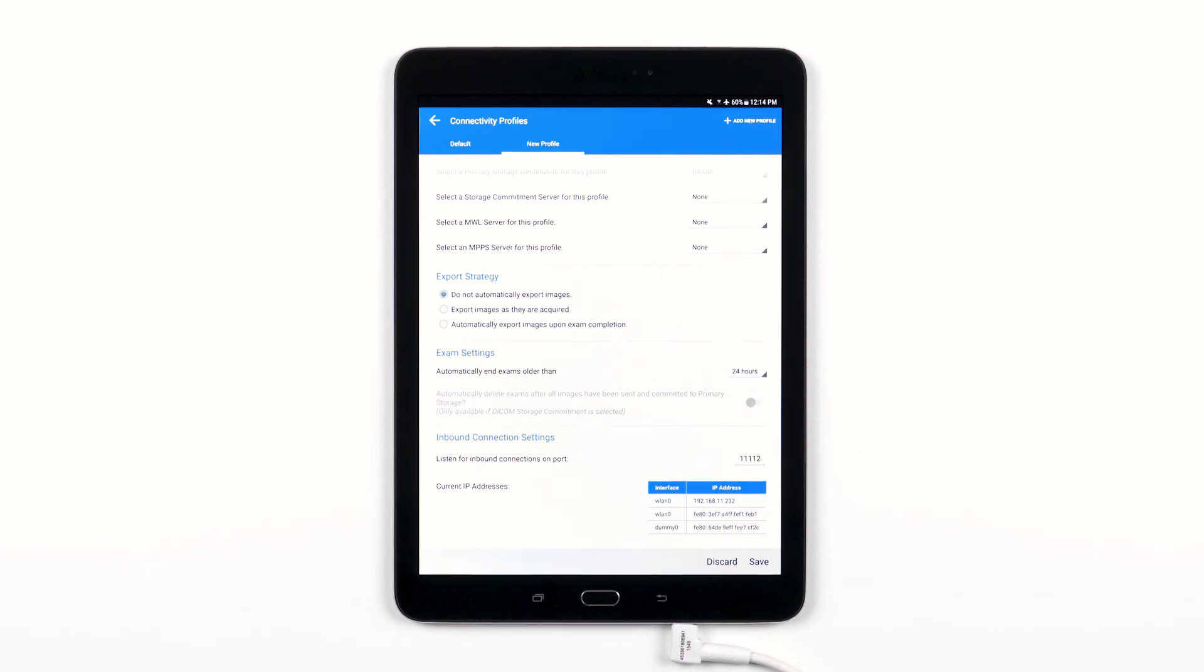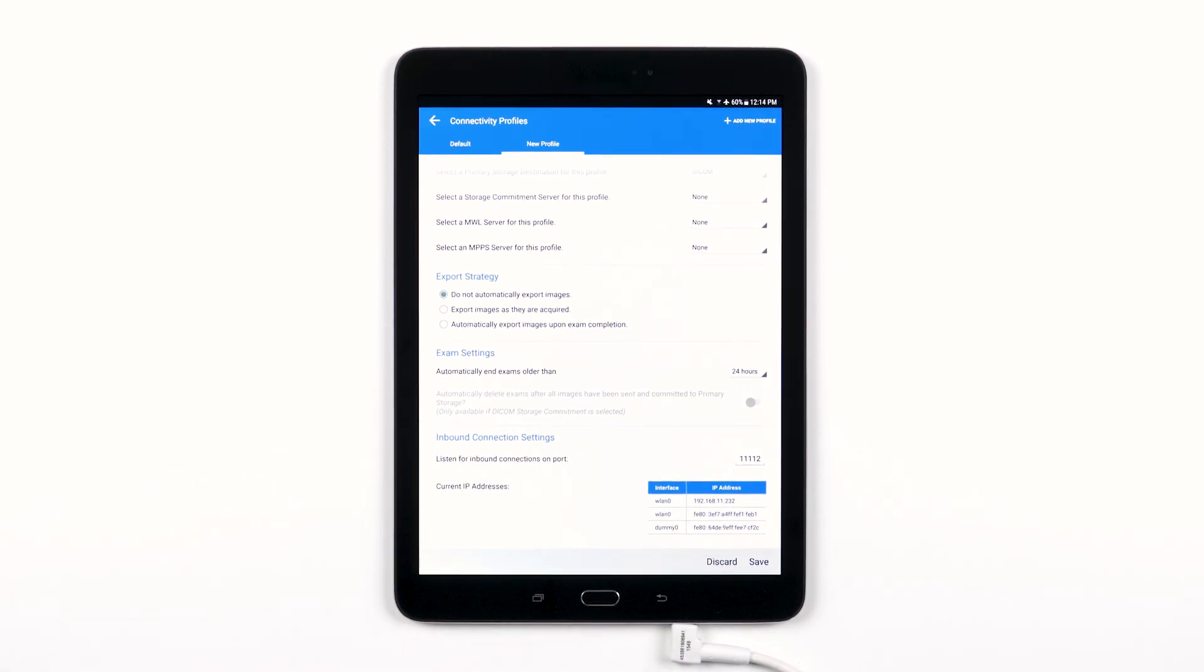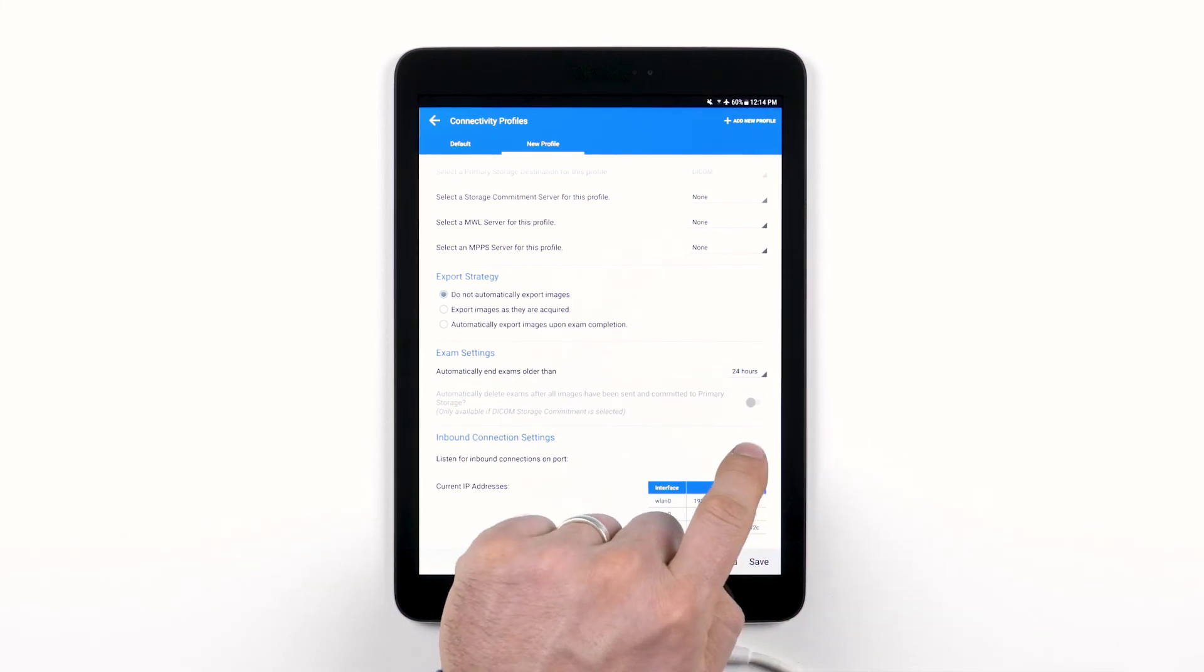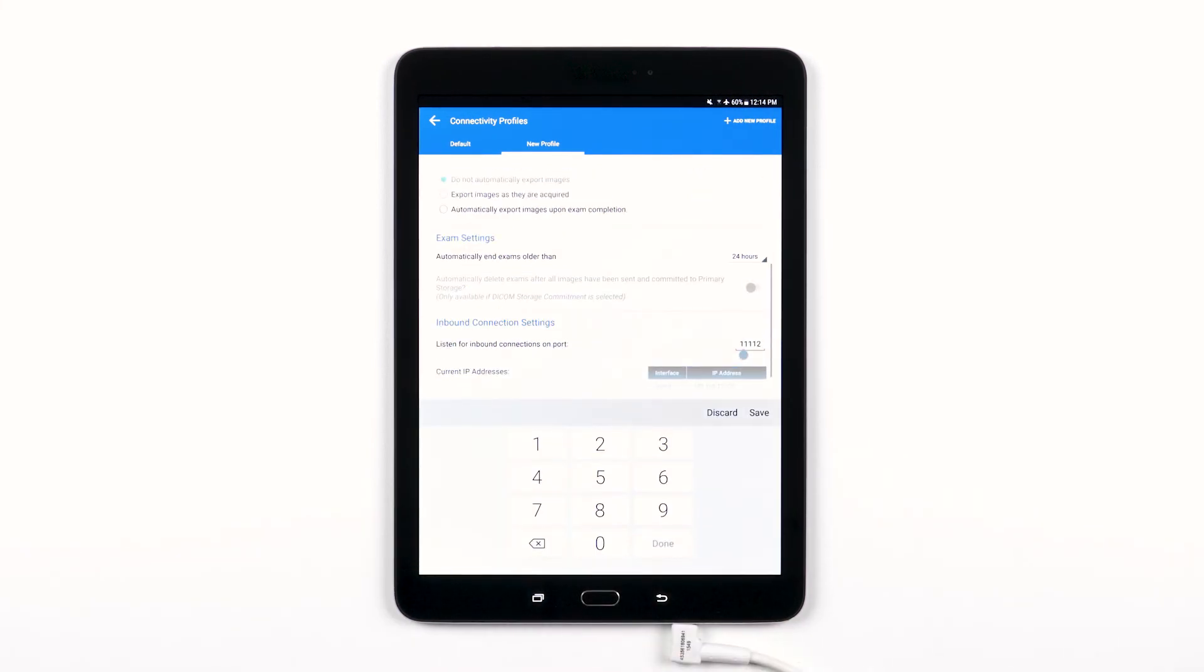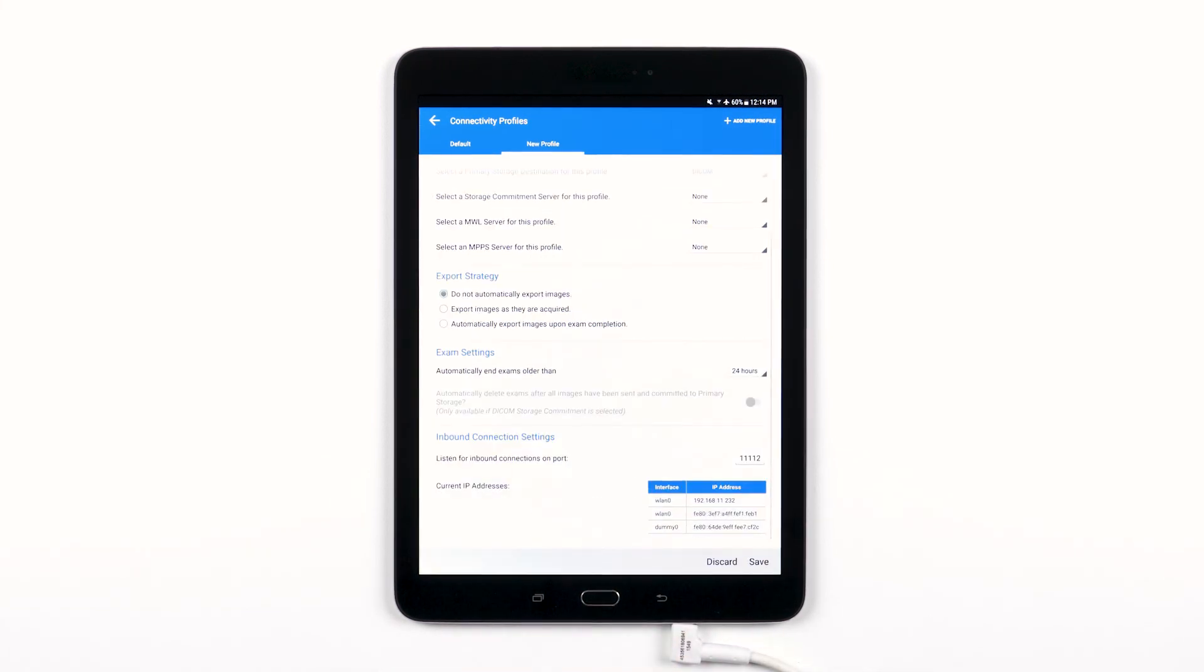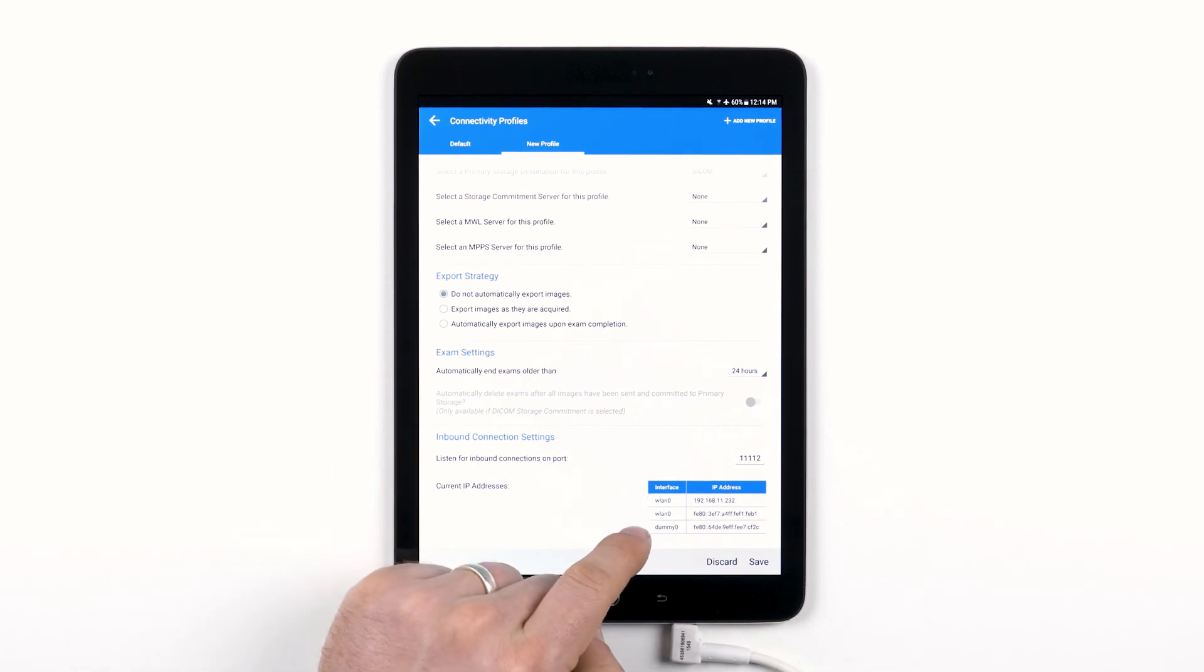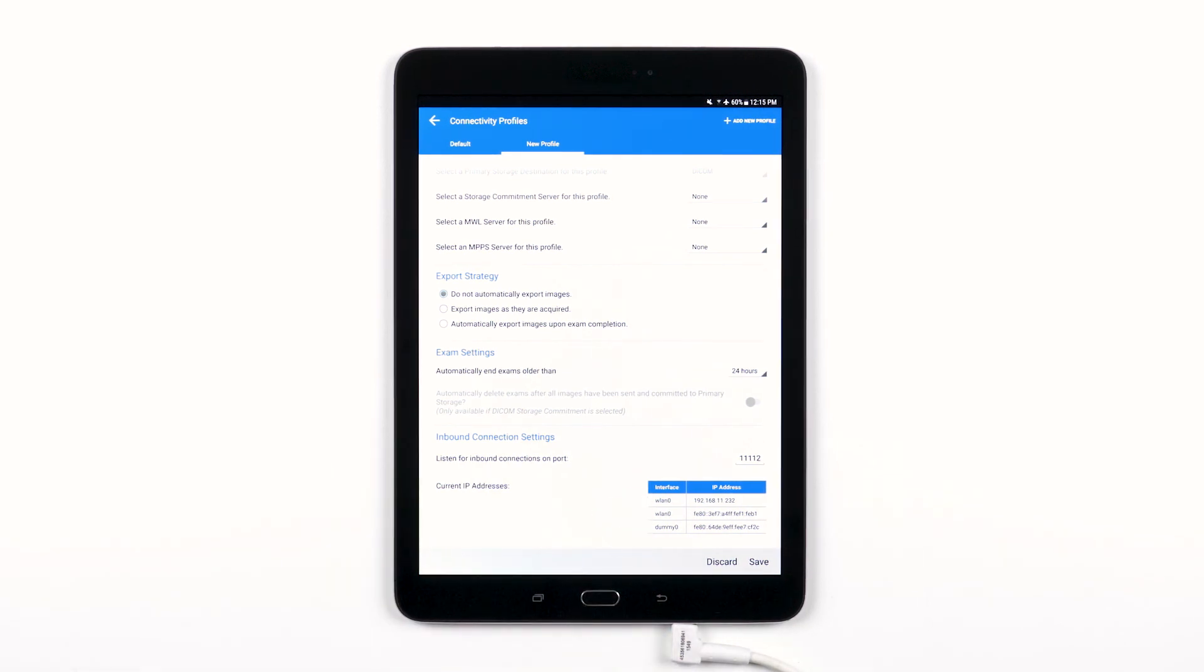At the very bottom in the Inbound connection settings, you can scan for a specific inbound port by tapping the Listen for inbound connections on port field. Just type a valid port higher than 1024 and then touch Save. You can also view the interface and IP address of your device's current inbound connections.